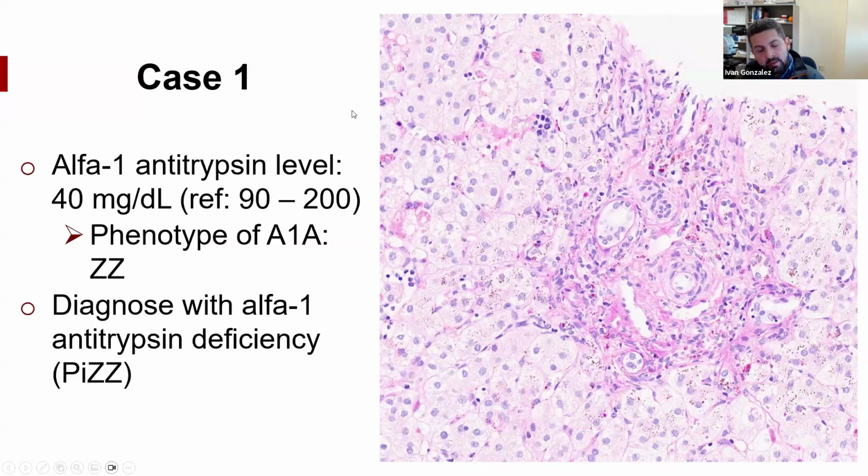It's really hard. The important thing to know is what you're staining with your PAS with diastase is the abnormally accumulated protein. When you have a kid of 7 weeks, 8 weeks, there hasn't been enough time for the protein to accumulate. So you won't see that classic big globule with a clear halo around it that you see mostly in your adult patients.